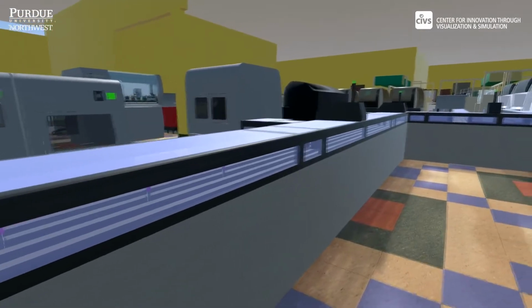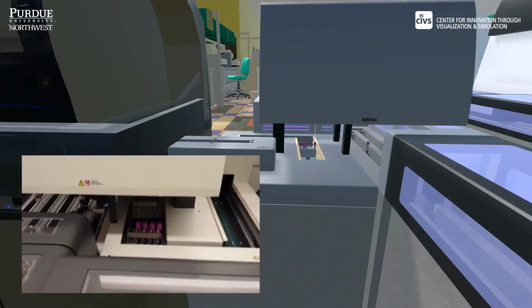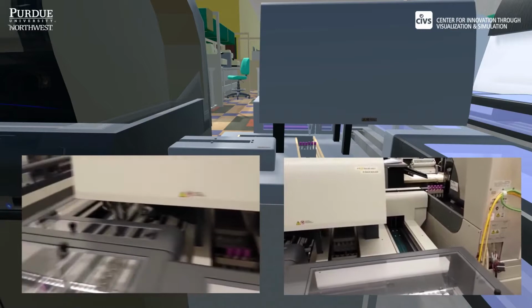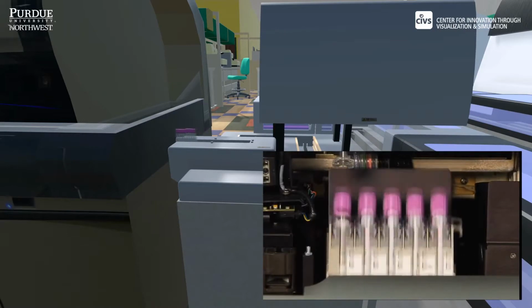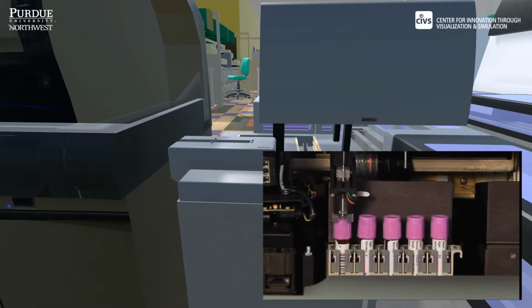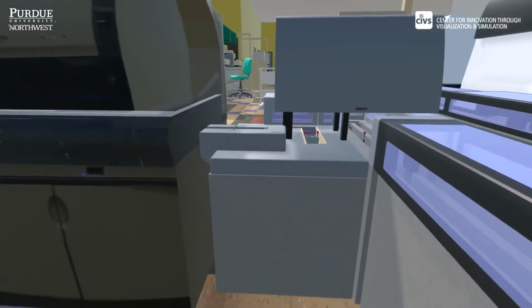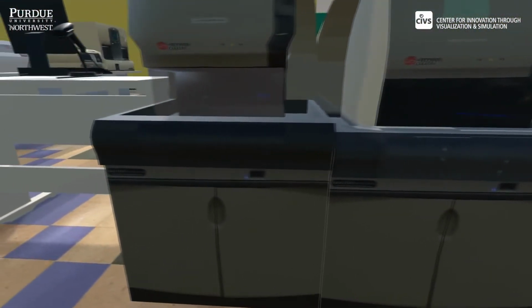As we visit the hematology area, the specimens arrive at the rack builder and are placed in the next open location in the rack. When the rack is full, or when 60 seconds have elapsed, it will enter one of the 3 DXHs. If some of the result parameters are not met, the specimen will travel to the slide maker stainer, where a slide is prepared from the patient's sample, and a technologist will prepare a manual differential, which generally is the counting of types of white blood cells, looking at red blood cell morphology, and estimating platelet counts and sizes. Typically, about 10% of CBCs require a manual differential.